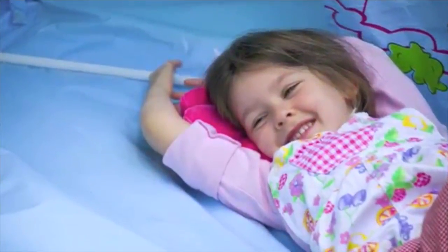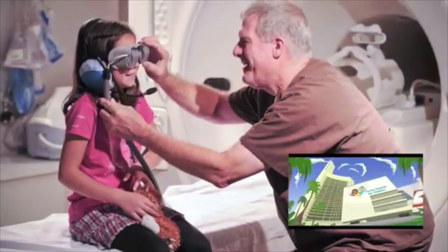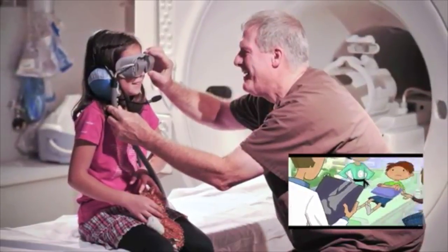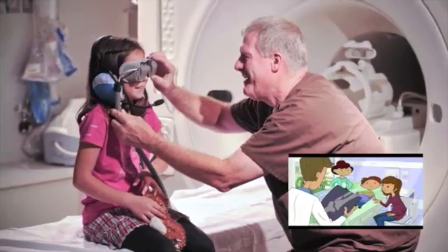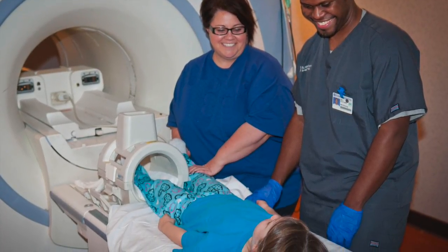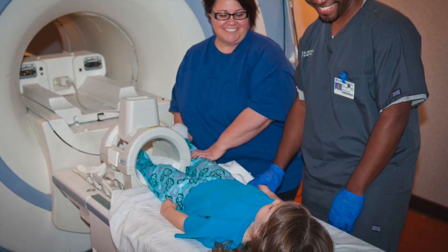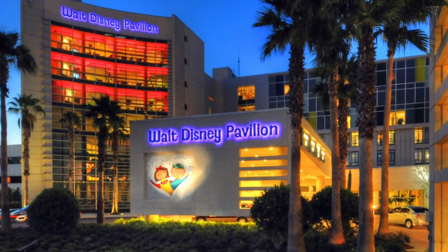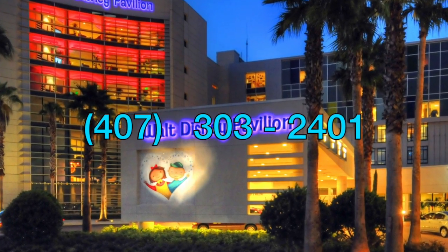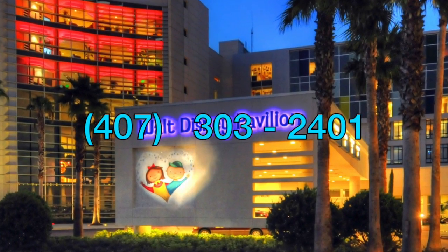Oh wait, we almost forgot the best part. While you're getting your picture taken, you get to watch a movie or listen to your favorite music with these awesome goggles and headphones. And remember, you're never alone. The person that takes your picture will be with you the whole time. We hope this helps you get ready for your MRI pictures. And if you have any questions, your family can call our Child Life Specialists. We look forward to seeing you soon.